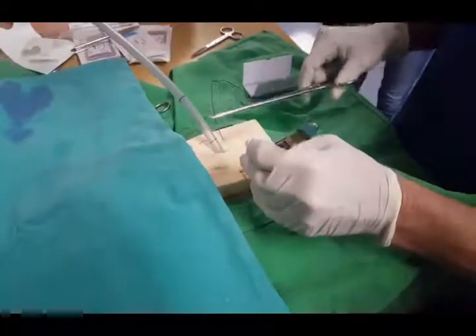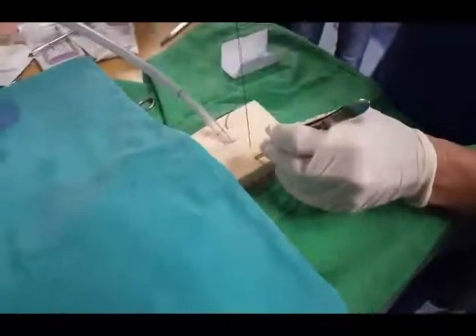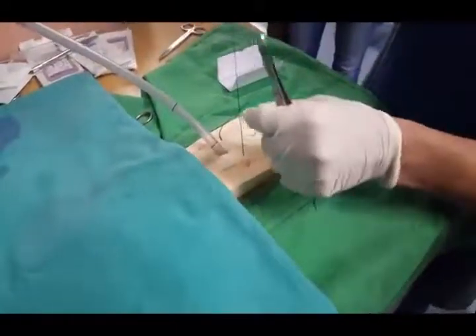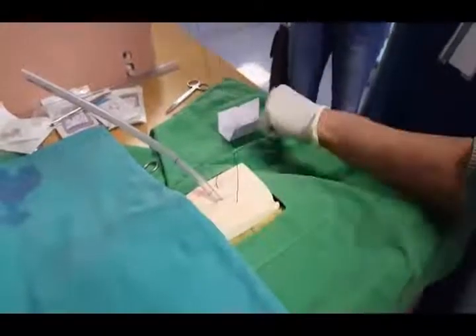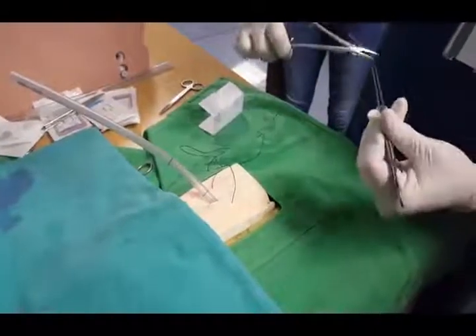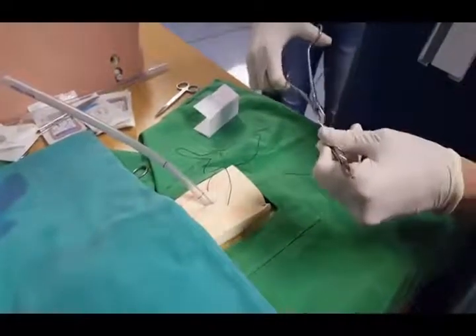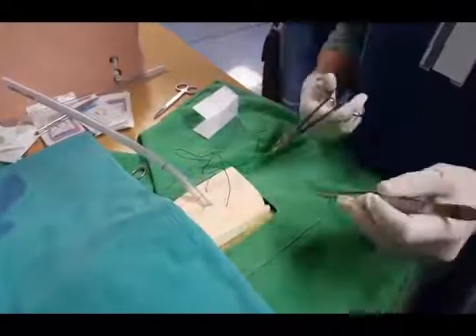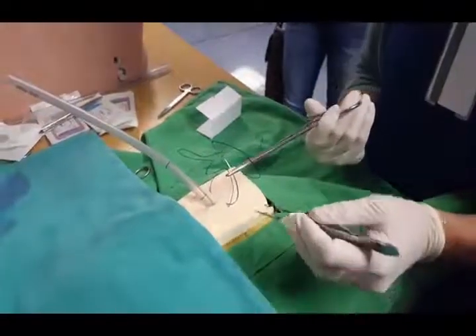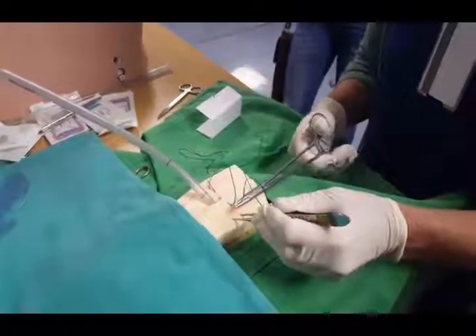The 'far and deep' is probably a bit of an exaggeration — it's just so that you can get an idea. Then what you want to do is pull through so that you've got long tails. You want to be safe when you're handling your needle. Then go in shallow and close, shallow and close.